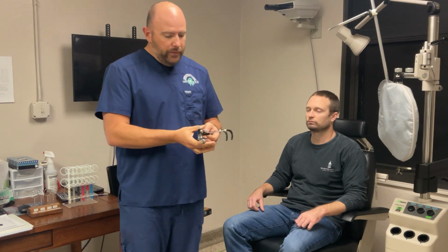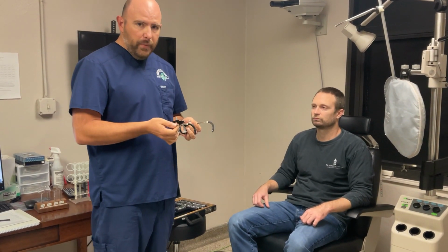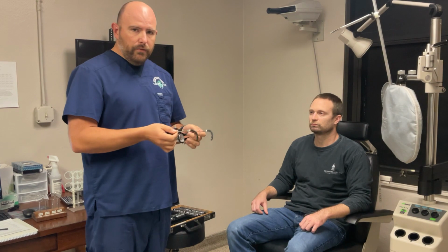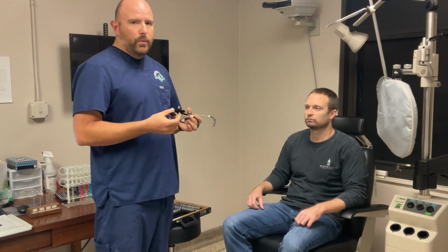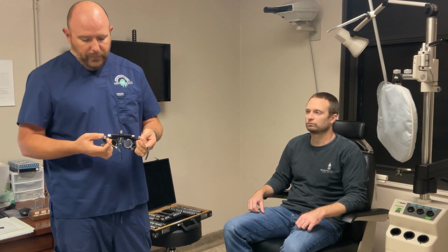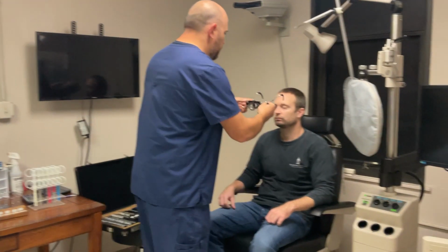As part of the proficiency, we're also going to ask the students to place the trial frame on the patient's face correctly and then make adjustments. We want the clinicians to be careful placing the frame on the patient's face. We don't want to jab somebody or hurt our patients. So I extend the temples all the way out, and then I pull them apart just like so, and then I'm going to bring them over here and place them on the patient's face.